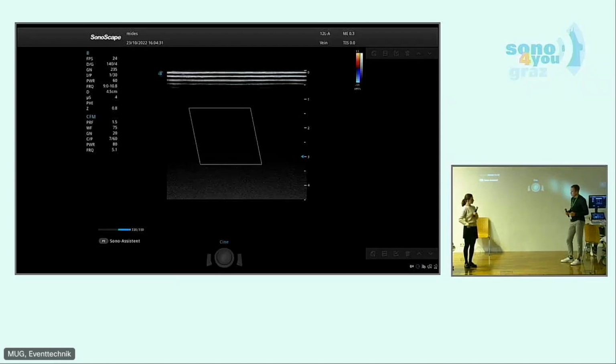For the inguinal region it is simple. It's this mnemonic IVAN: inside vein, artery, nerve. But for the popliteal region, it's a little bit complicated. It should be that the vein is medial to the artery and nerve, but as you have seen, it's not really like this in reality. So when you have a problem, always try to compress the structure. Usually it compresses only the vein. The artery will pulsate, so you will see this small pulsation even when you don't do the Doppler examination.